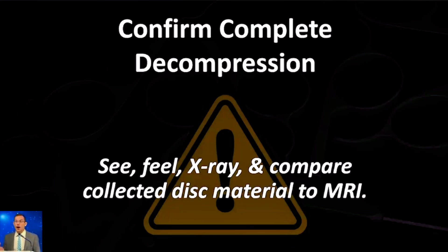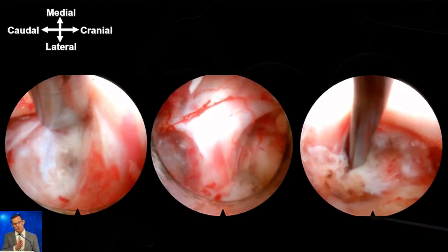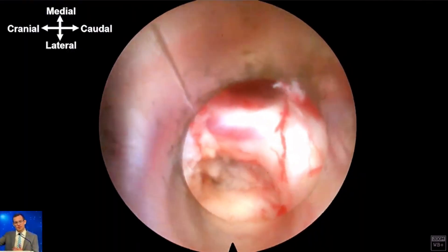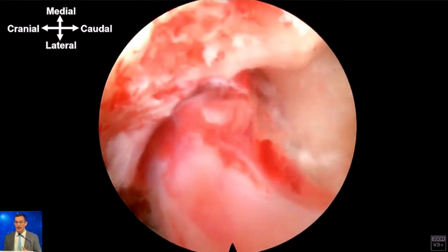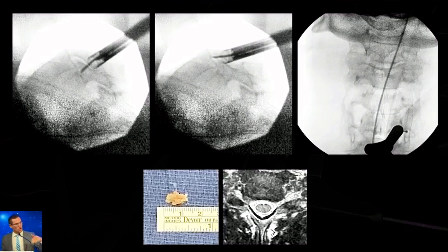Then confirm your decompression is complete. The first way is visualization and palpation: retract the nerve from below and then from above to confirm it's free and mobile with nothing compressive underneath. My favorite part of the case is rotating the scope 180 degrees to look back toward yourself — an out-of-body type experience where you can actually see the C6 and C7 pedicles sloping away and be very confident you've done a good decompression. I also get x-rays with a probe at each pedicle, and I save the disc material to correlate with what I'd expect from the MRI.